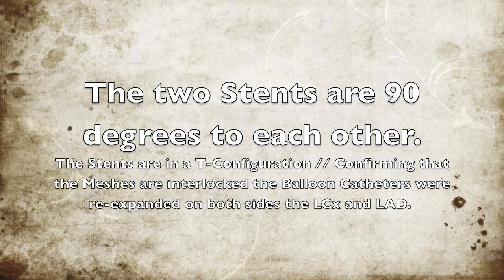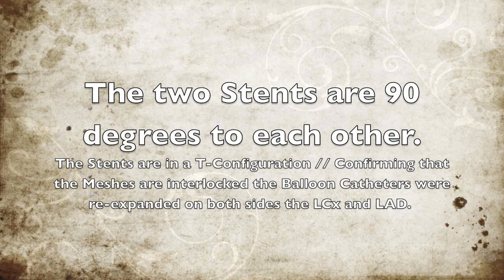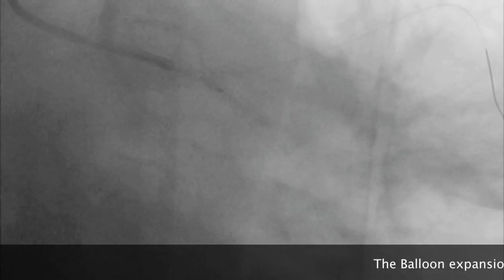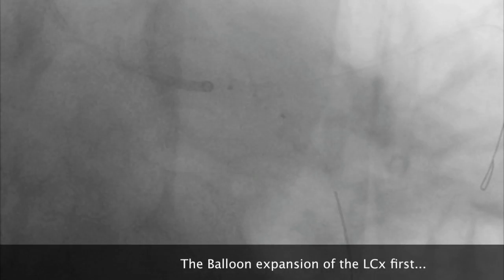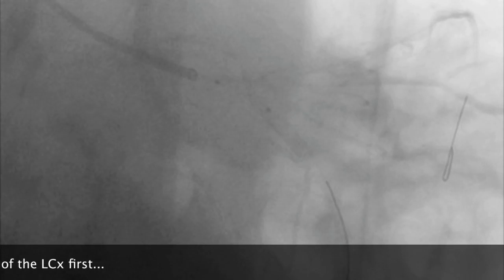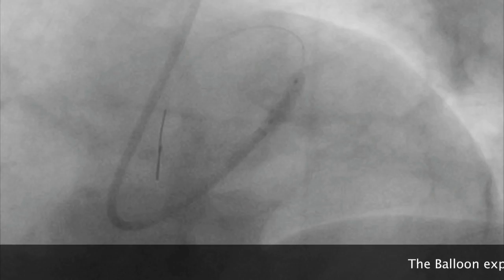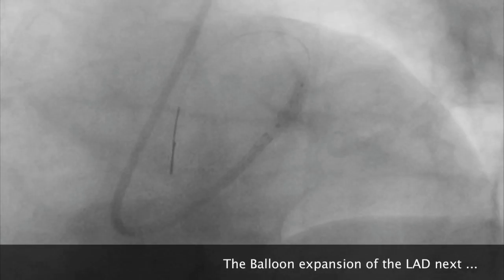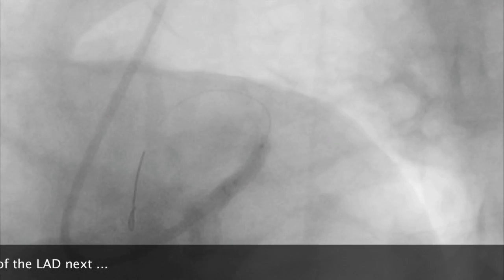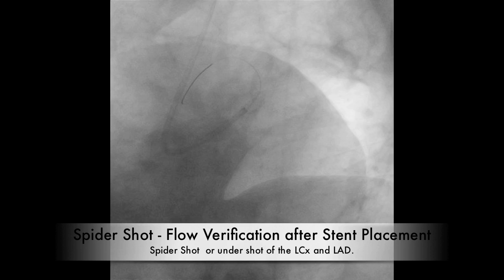The two stents are 90 degrees from each other in a T-configuration, confirming that the meshes are interlocked. Balloon catheters are placed in and expanded again — we see the two dots where the balloons are located. They expand the balloon to make sure the stent in the LCX is good, then put the balloon back into the LAD and expand the LAD stent to make sure it interlocks with the LCX circumflex artery.